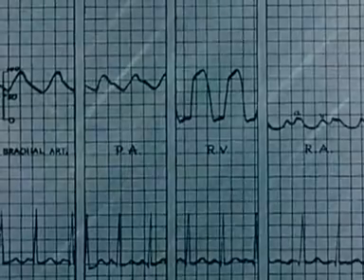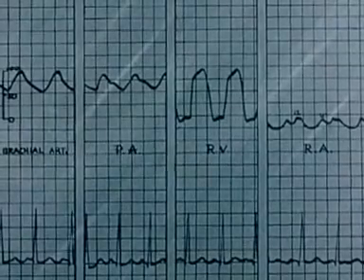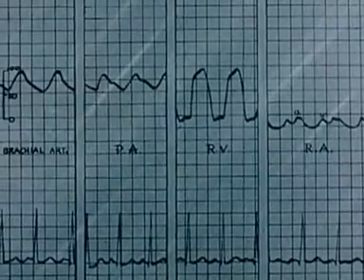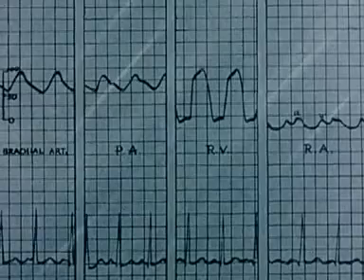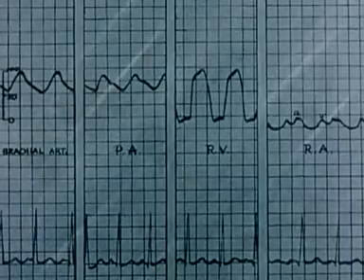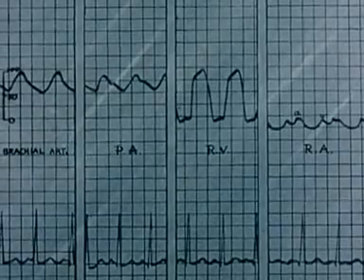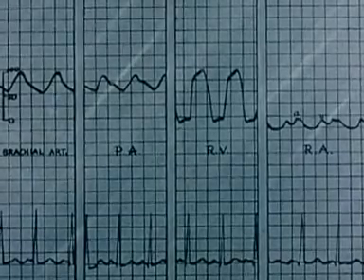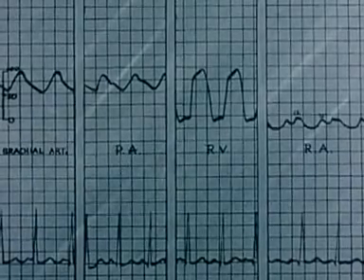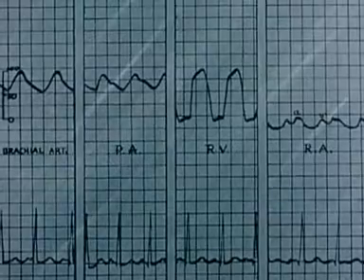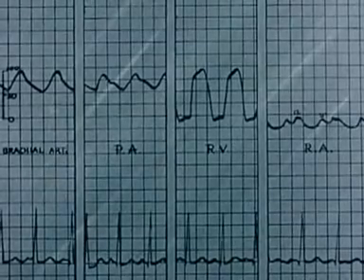The brachial artery pressure, pulmonary artery pressure, and right ventricular pressure are all around 100 millimeters of mercury. The right atrial tracing, shown on the right, shows A only slightly higher than V, both around zero.